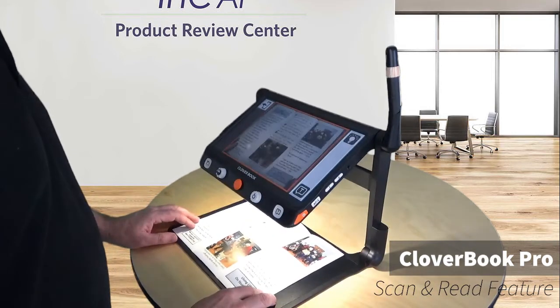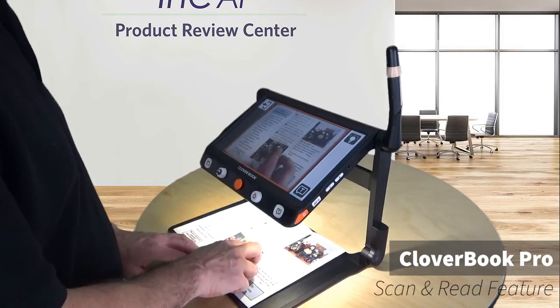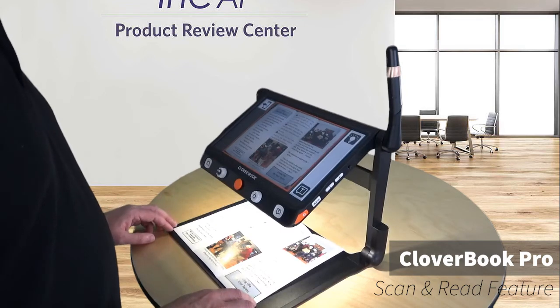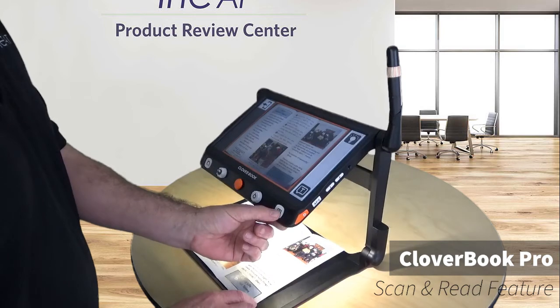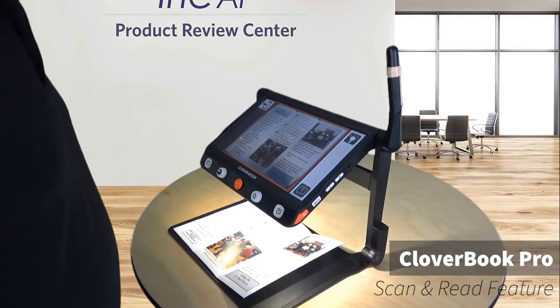It brings up an orange rectangle, makes it easy to see so that I can scan this guy and get the entire brochure all in one scan. Now there's a T on the screen that I can use, or I can use this same button I used before. I'm going to just scan that and we will get a full page scan.